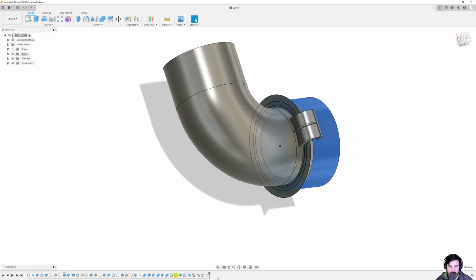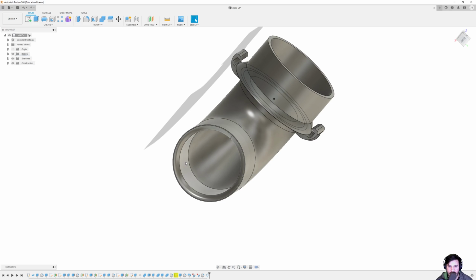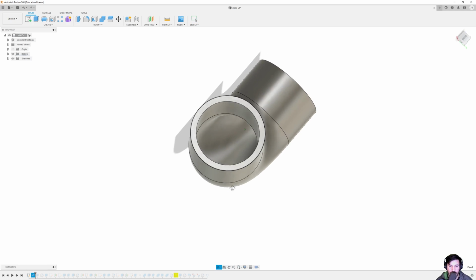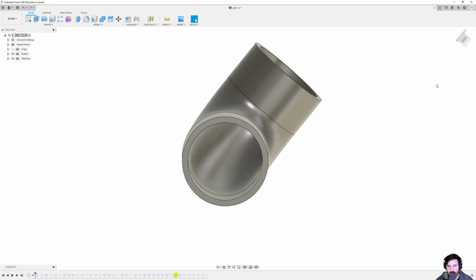So I am kind of new to Fusion 360. I really only used it once or twice before, which I've shown on stream before, but I've been trying to make use of this timeline, which is not something I've ever done before. At one point this inner diameter right here needed to be revised, and instead of redoing the whole thing, I could step back in time all the way down to here, go in and do edit, and redefine this diameter, and on the fly it would change it.